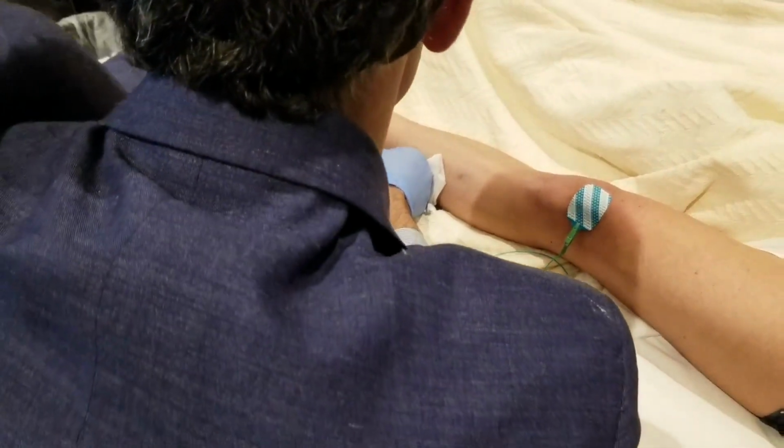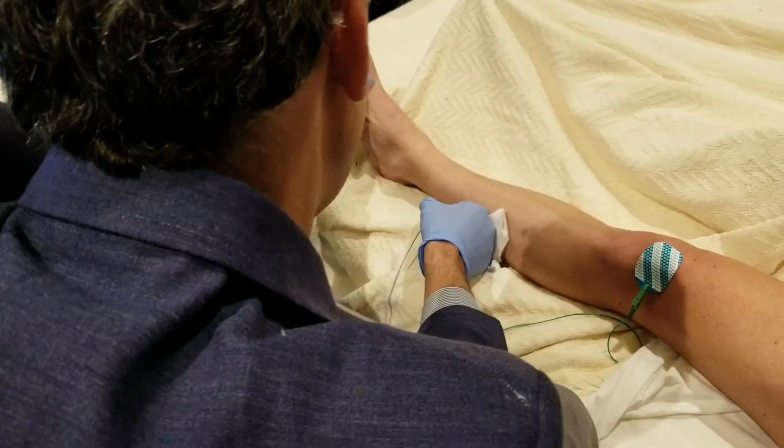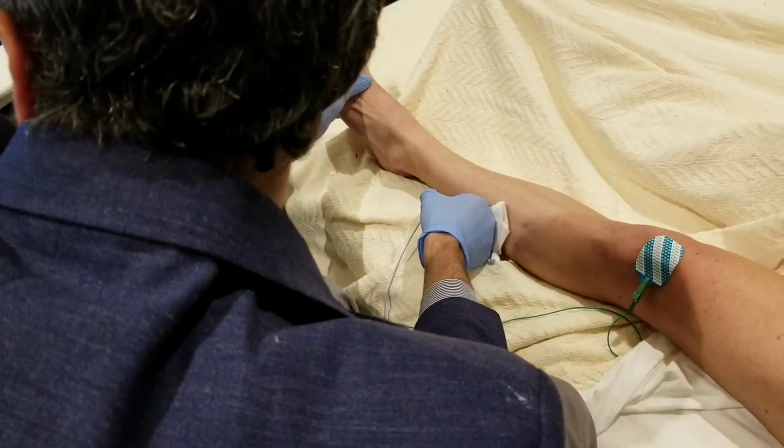And the maneuver is basically dorsiflexion of the ankle. Bend your foot up just a little bit. There we go.